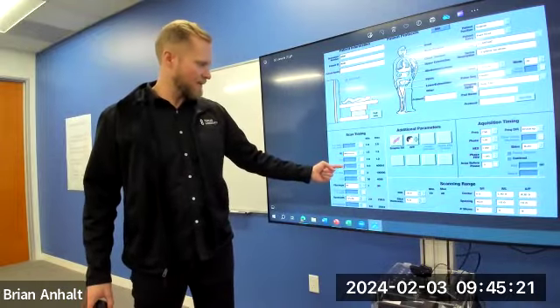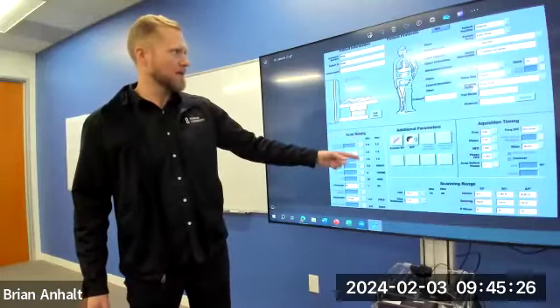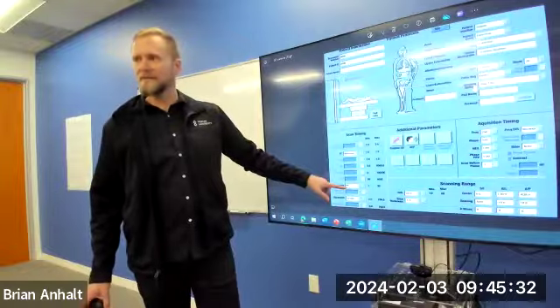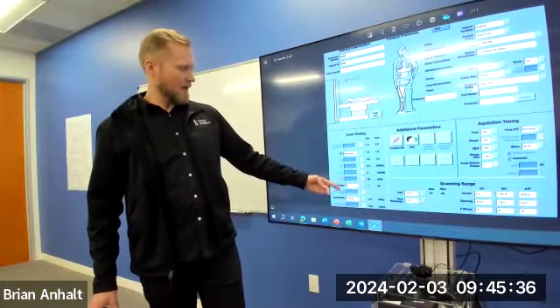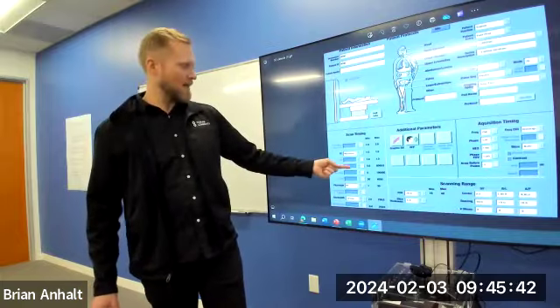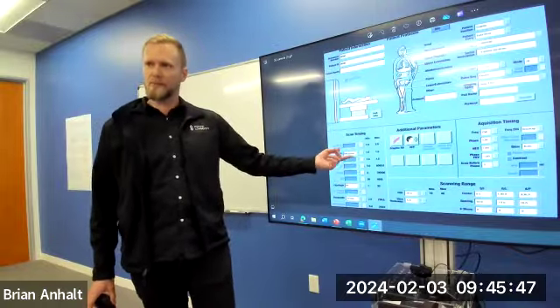TR is a function of the flip angle in this type of pulse sequence that we're running here. It's a gradient echo sequence. We can tell it's a 60-degree flip angle, right? So the TR is a function of the flip angle. Remember, TR and flip angle determine your T1 weighting, right? So it's not letting you prescribe the TR because you see it's grayed out, but in other sequences, you would prescribe the TR.